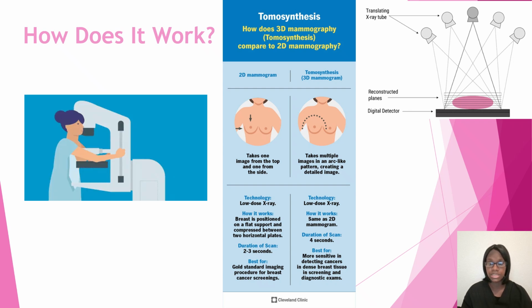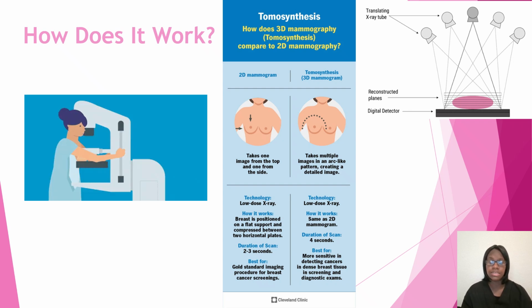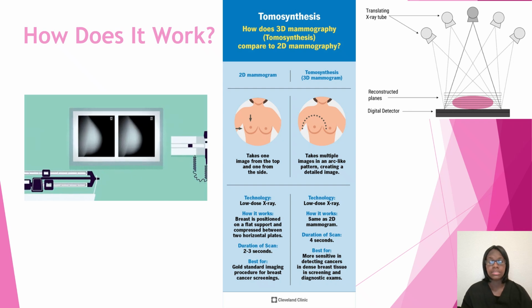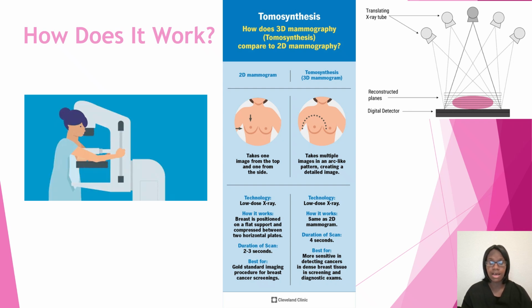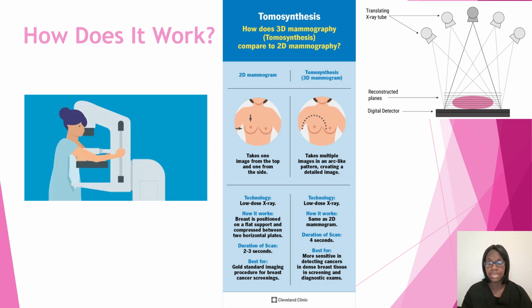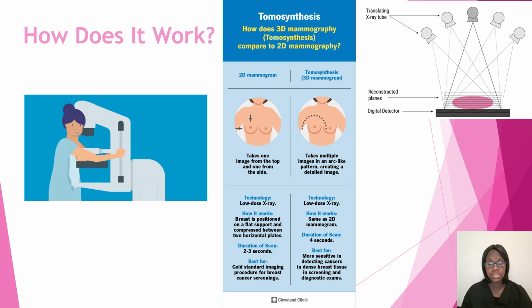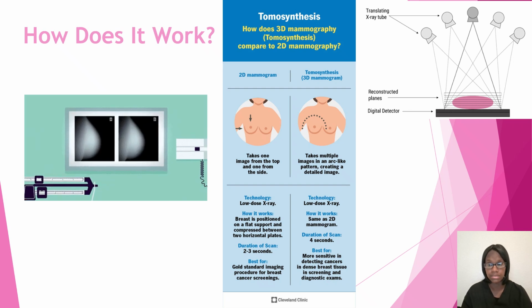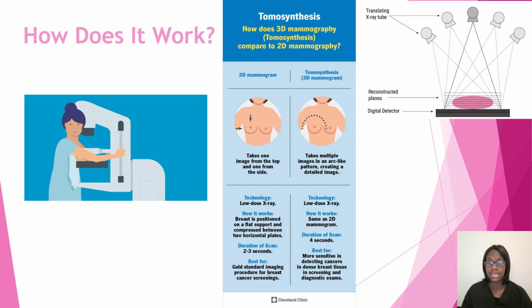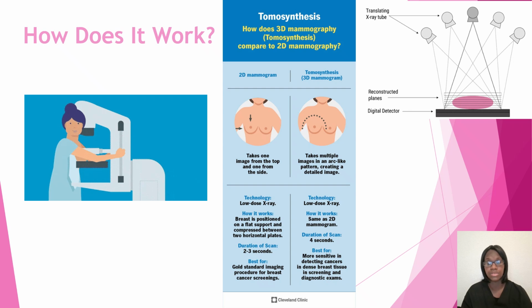At the beginning, you're going to hear the machine making a beeping noise, and then the patient is going to either relax or hold still. It all depends on how you give your patients breathing instructions. When I was a student, I was trained by different techs, and one tech trained me to tell the patient to hold their breath, then relax, and then hold their breath again. But you also see some techs who just tell the patient to hold still at the beginning, and then they hold the breath at the end. I'm just giving you different examples of how techs are taught and trained. I'm not going to tell you which way is right or wrong. I'm just putting that information out there.